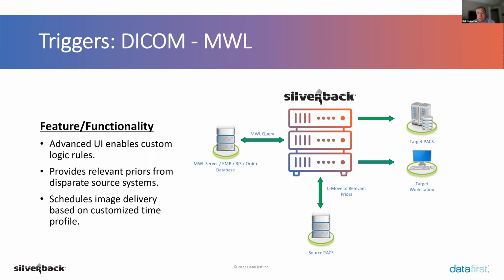I say viewing solution, but it could be a target PACS that has standard viewing, or a particular workstation. Those moves are all rules based, so we could deliver those priors to multiple destinations at one time.